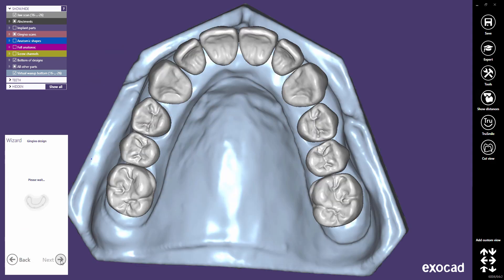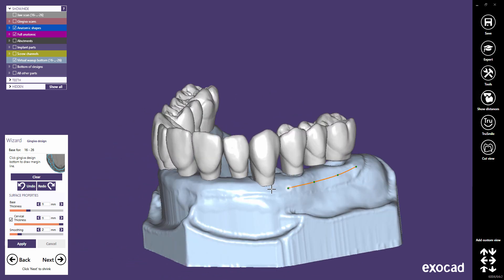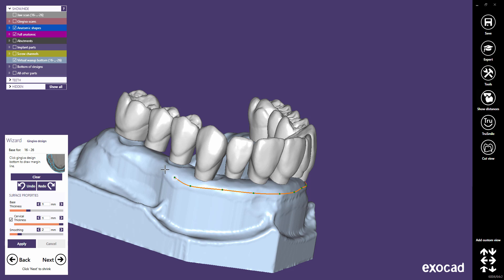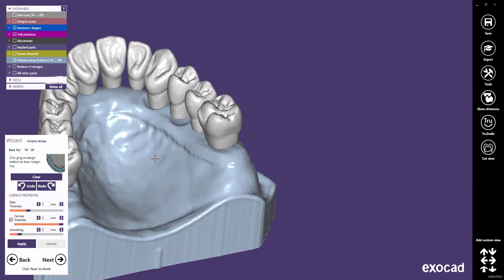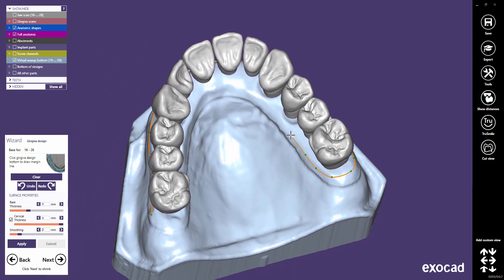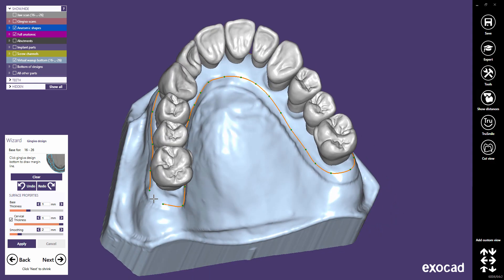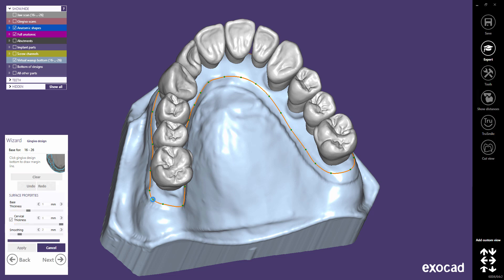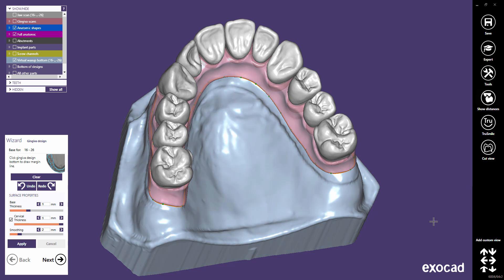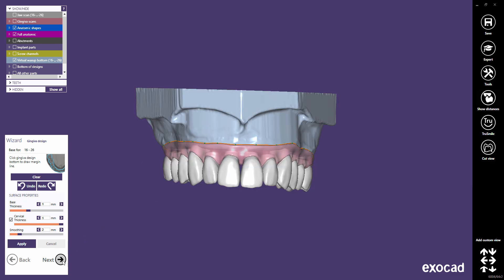Proceed to the Gingiva design step to draw the margin of the gingiva. Add as many points as required to define the gingiva area. Finish the drawing with a double-click. Then proceed to the gingiva design step.